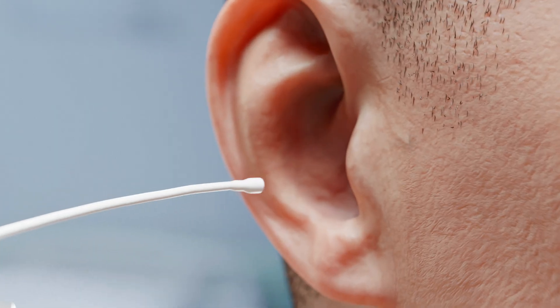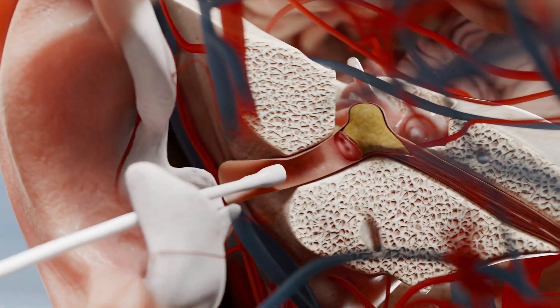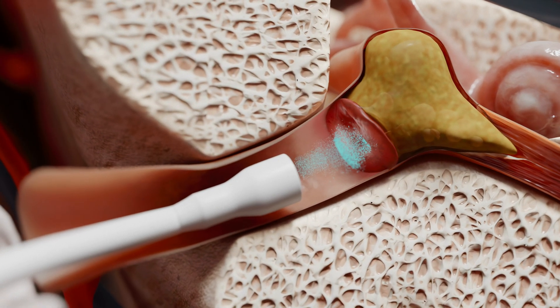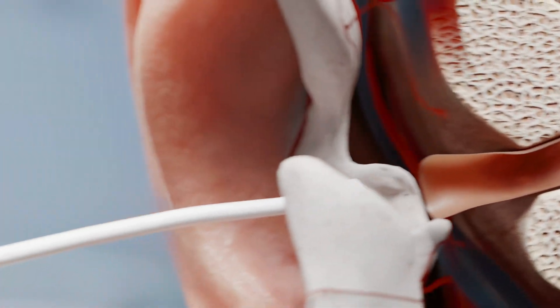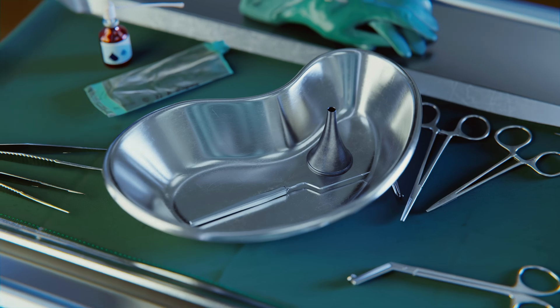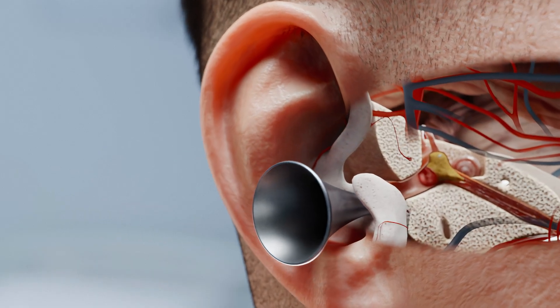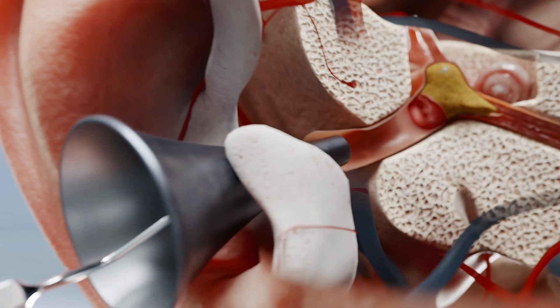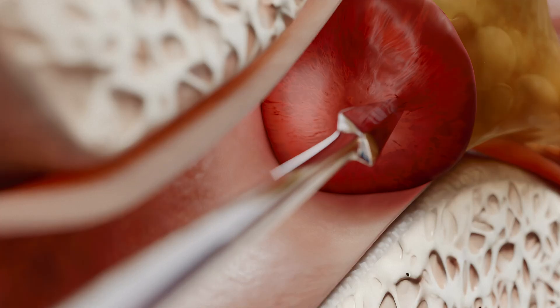The procedure is performed under local anesthesia. Indications for myringotomy of the eardrum are severe pain, exudate that may evolve to suppuration, progressive hearing loss, severe intoxication, as well as the risk of spontaneous perforation and complications. Myringotomy is performed in the antero-inferior quadrant of the eardrum, which minimizes the risk of damage to the auditory ossicles and other anatomically significant structures.